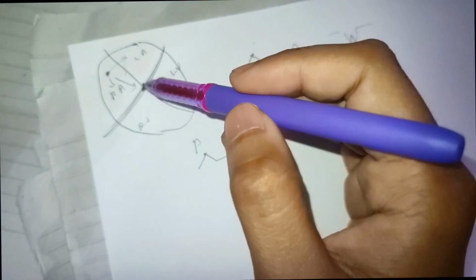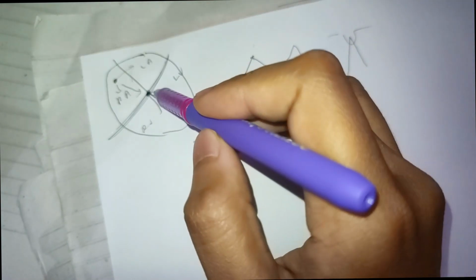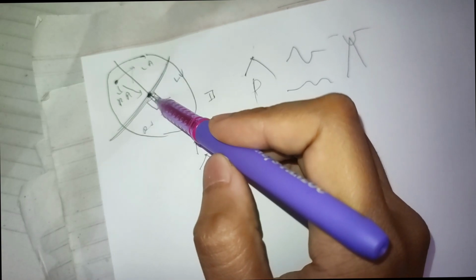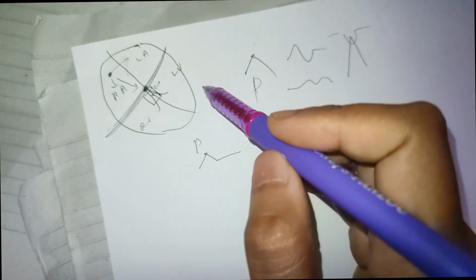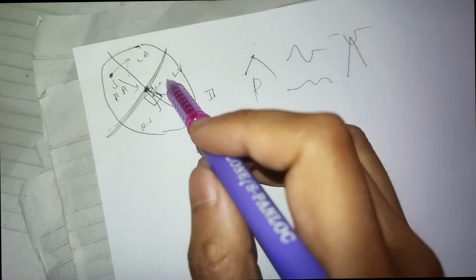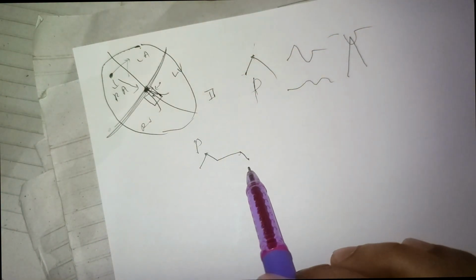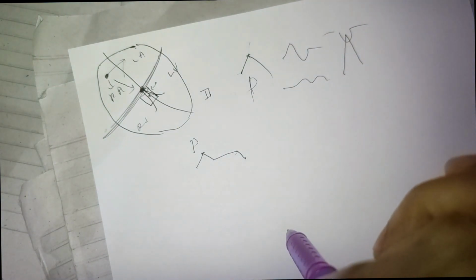Now the current travels in the left bundle branch, right bundle branch, and there is a septum, right? This interventricular septum. So the current first of all comes to the interventricular septum, right? And the septum depolarizes from left to right. So if you see in the left precordial leads, there is a small Q wave because the current is moving in this direction. So in these sided leads, there is a small negative deflection like this, right? So the ink pen makes the deflection like this.